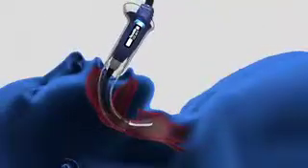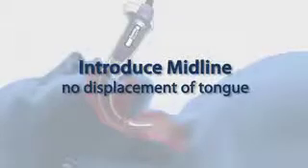Unlike conventional laryngoscopy, the Glidescope videolaryngoscope is introduced midline. No lateral displacement of the tongue is required.